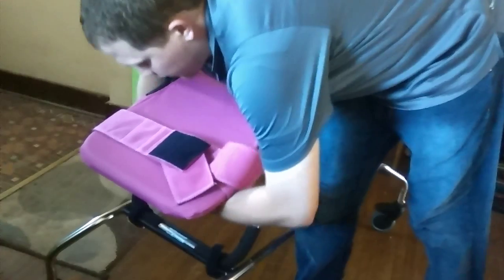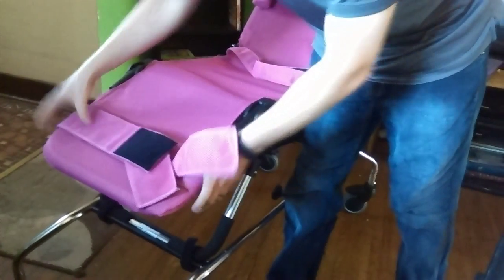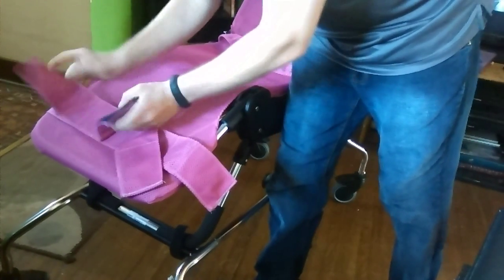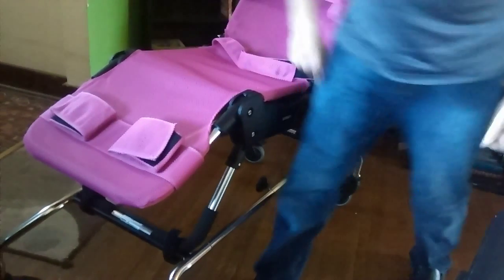The last thing is the ankle strap here. This will strap right around here. We want to get this down towards the bottom — about two to three inches from the bottom — and it just velcros underneath there. Then each leg will be strapped in there.